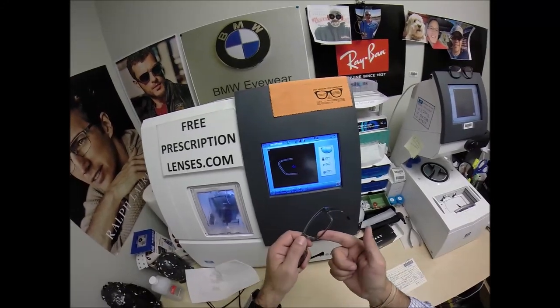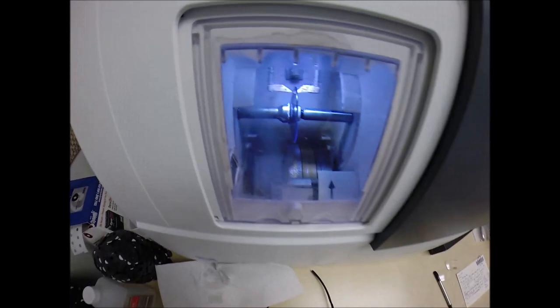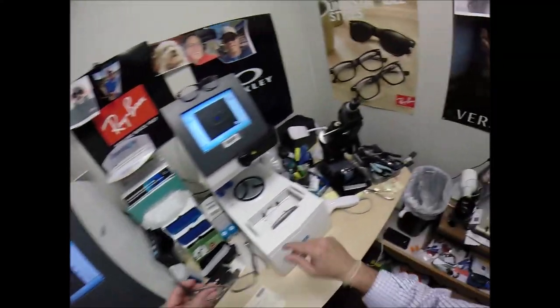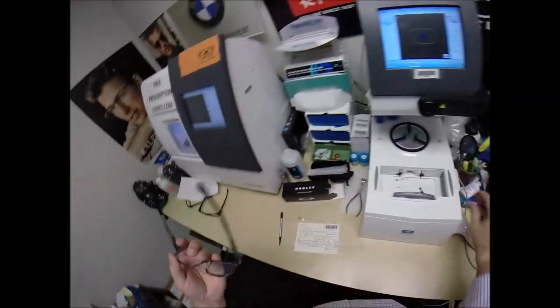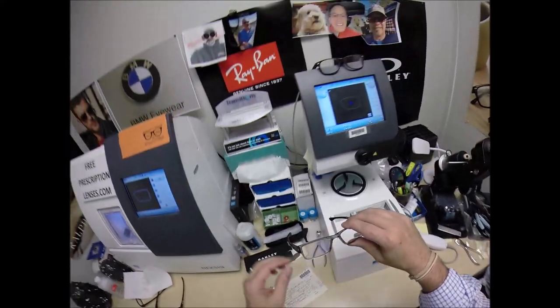And you can see as it's tracing the left side, ding, you may now turn the page. And of course, measuring the thickness of the lens at every point to know where to place the bevel for the best cosmetic look possible. Although, what I tell you, Leif, you got no edge thickness, none. No edge thickness whatsoever. That's why I use the thinner, lighter weight lenses that I mentioned were unbreakable and are impact resistant as well.